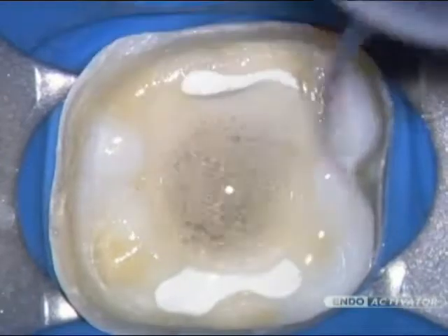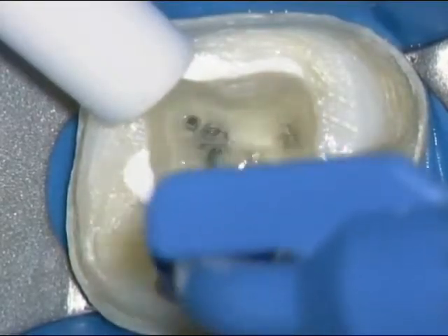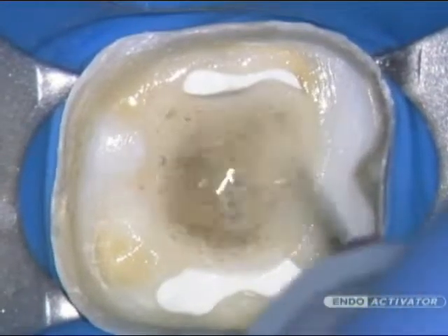During cleaning procedures, agitate the intracanal solution for 30 to 60 seconds. Then irrigate and use intracanal suction to remove loose debris. This process should be repeated for each intracanal irrigant used.